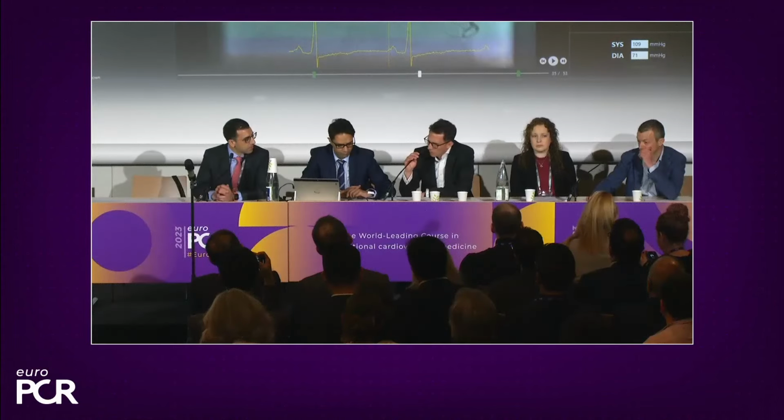If I can add one more point, the question is also how much are you really interested in a very distal FFR? I think from a clinical point of view, if you have a proximal or mid stenosis, you're not so interested in what the very distal vessel does, so maybe it's okay if you have a good FFR in the major vessel part, but if there is some ischemia very distal, it's clinically not so relevant.